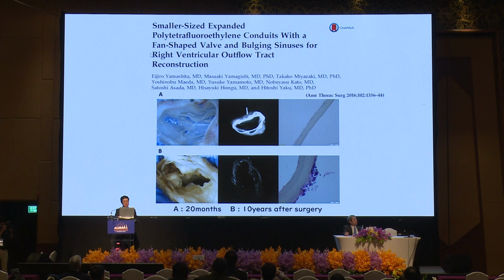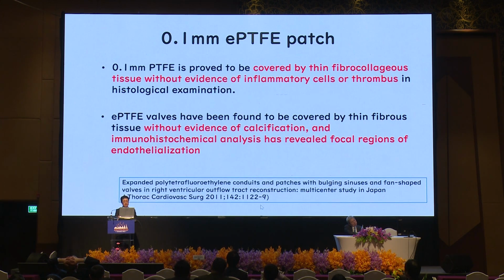I looked for better materials and found Professor Yamagishi's technique, in which he used 0.1 millimeter PTFE material to make a fan-shaped valved conduit to reconstruct the right ventricular outflow tract. The 0.1 millimeter ePTFE patch has been proven to be covered by thin fibrocollagenous tissue without evidence of inflammatory cells, thrombus, or calcification in histological examination.